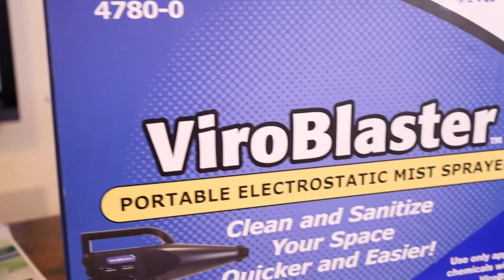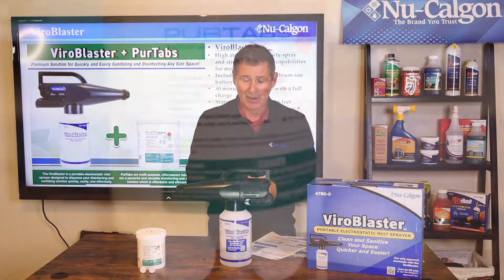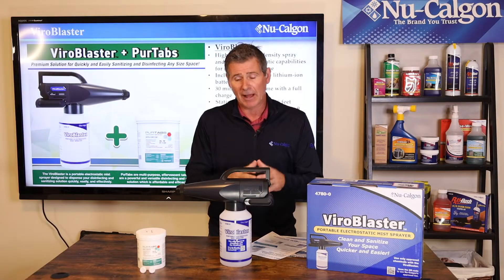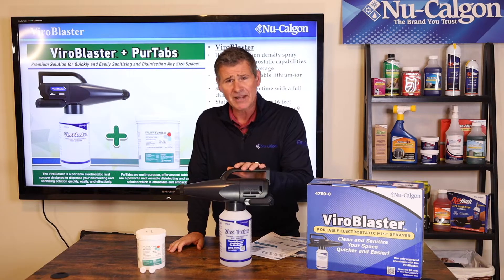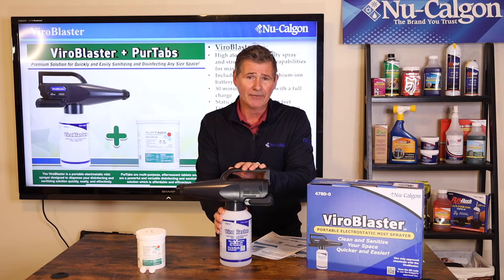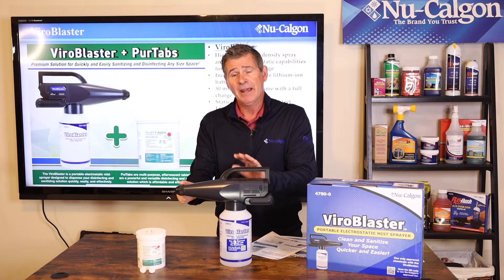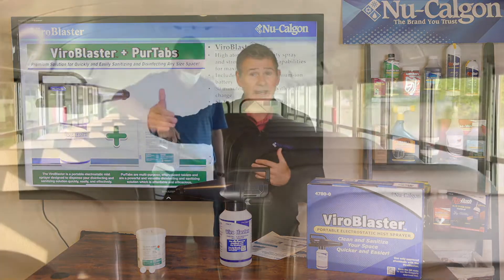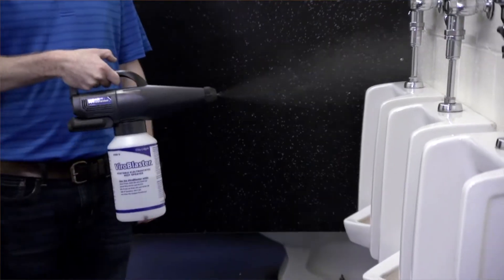We're going to talk about our PurTabs, which go inside the ViroBlaster to help sanitize and disinfect surfaces that are hard and non-porous. The ViroBlaster itself — I have it right here — is a self-contained unit, easy to carry around. The container is about a half a gallon or two quarts. It does have an adjustable sprayer tip, and it will put out an electrostatic mist spray up to nine to ten feet away from you and cover a circumference of around 16 feet.